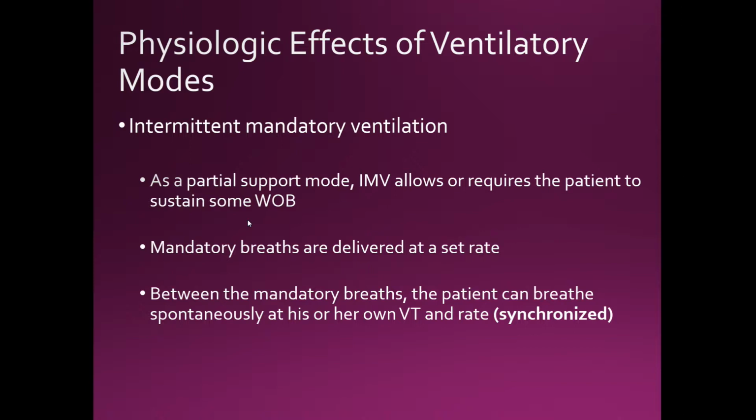If I have a patient that needs mechanical ventilation, but they're still awake and alert and oriented, I might put them on SIMV as a starting mode.